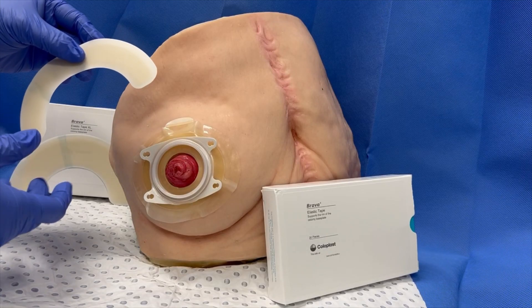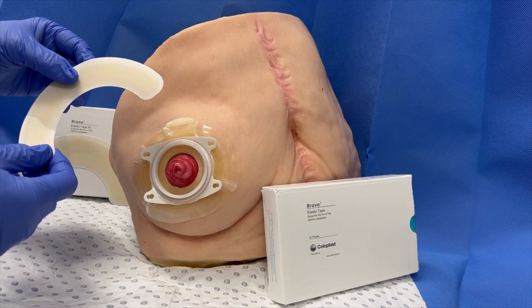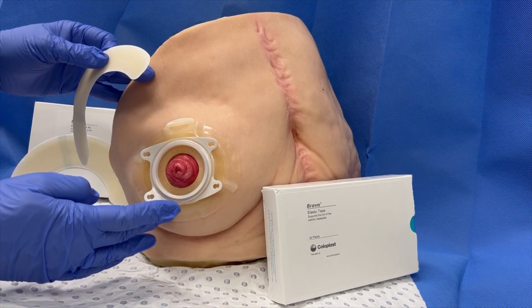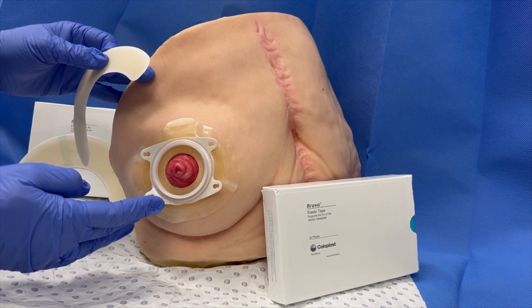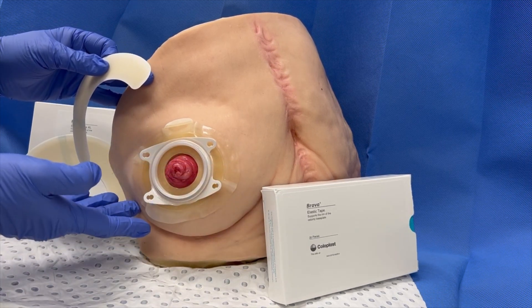The use of elastic tape, also known as adhesive extenders, can be very useful to help secure adhesive edges that lift, or when additional adhesive extension is required to mould around an enlarged hernia shape.